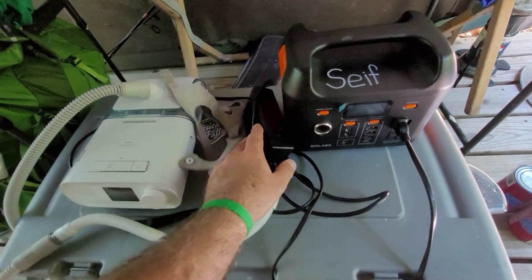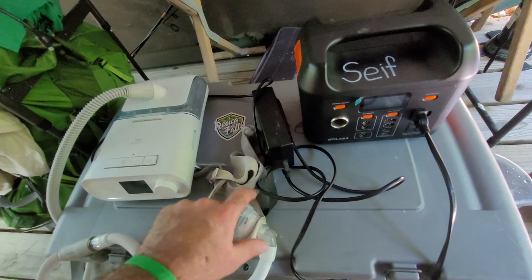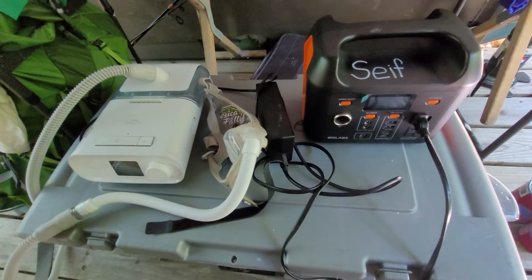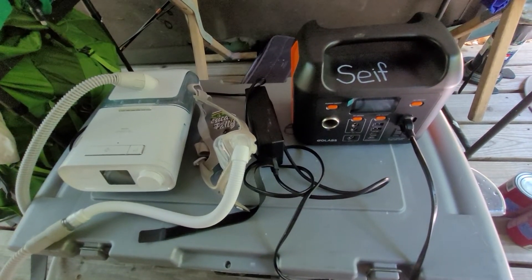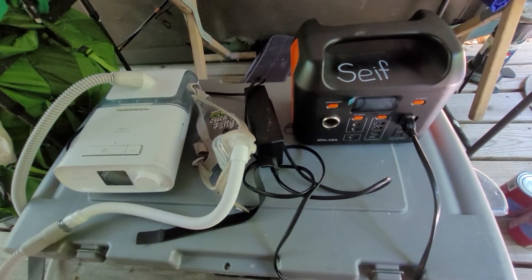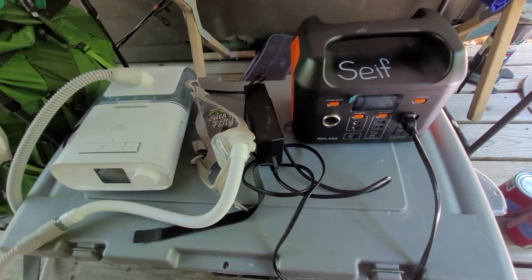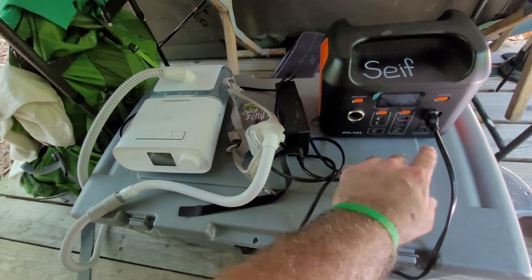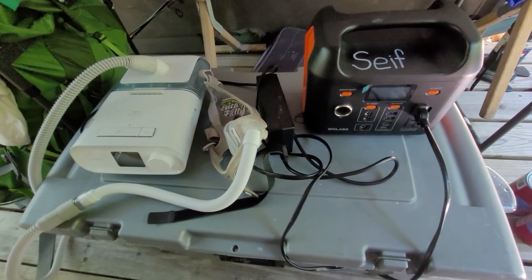Right now we're at Resica Falls in Pennsylvania and I took it down to the medical station and they let me charge it there during the day. We ended up having to go to the hospital with the kids, so it ended up getting left there overnight. It does take about four to six hours to charge up once it's totally drained. You can charge it other ways too, like with your car, but I just plug it into the wall.